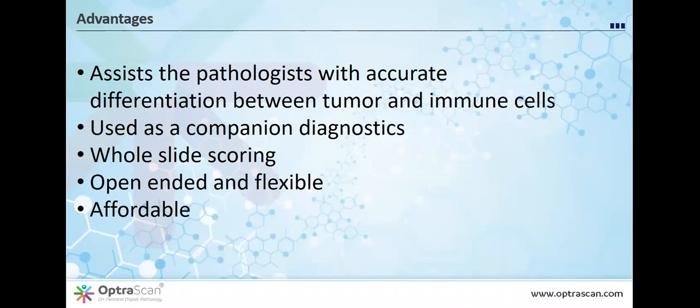Because, you know, initially we were looking for plasma cells with immunoglobulin, and I was identifying with great confidence plasma cells morphologically and ruling out other cells. And then we stained for immunoglobulin and found that our morphologic criteria weren't very good. So having a separate set of parameters that helps in cell identification is enormously useful. It improves morphologic acuity, and it gives a second independent, more objective assessment.